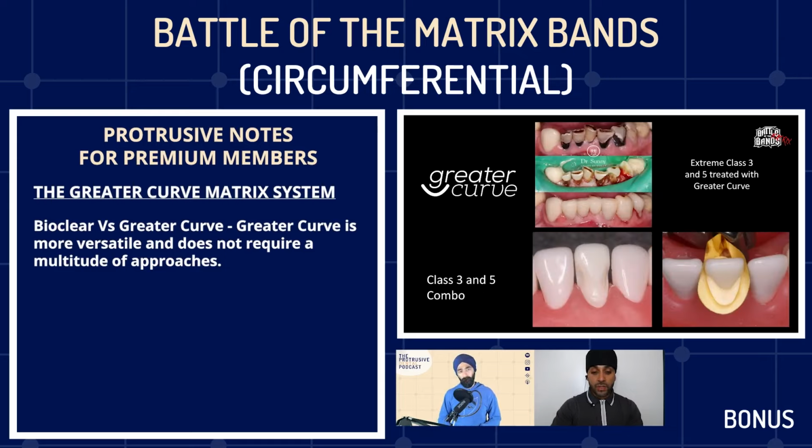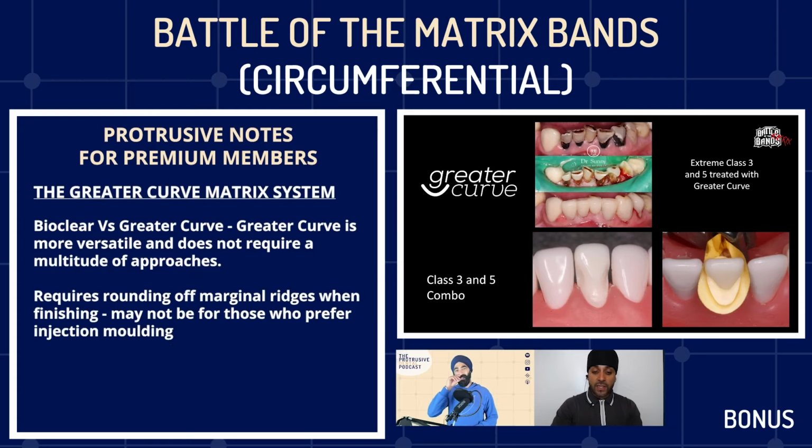Totally. And then just to illustrate as well, I'm sorry, we're still on the cons. So that was that. The system and technique also requires us to round off marginal ridges when finishing, meaning the dentist can sculpt in those contours.